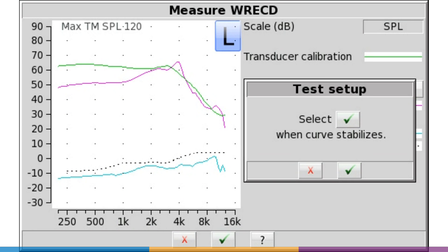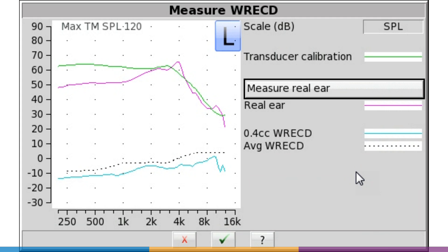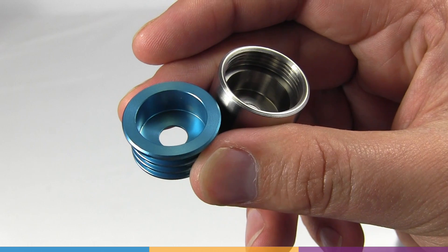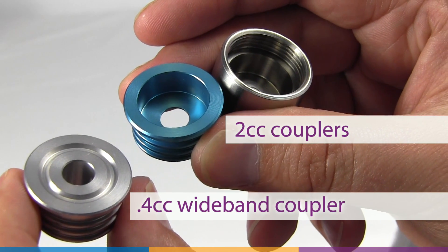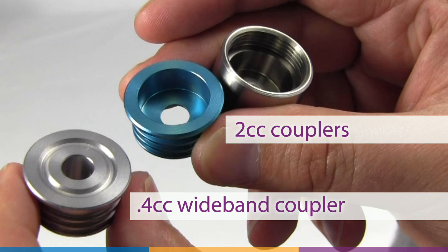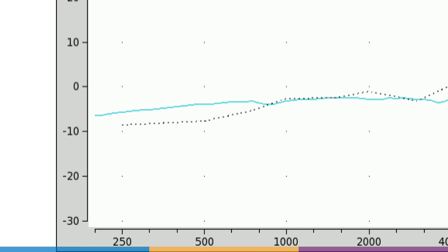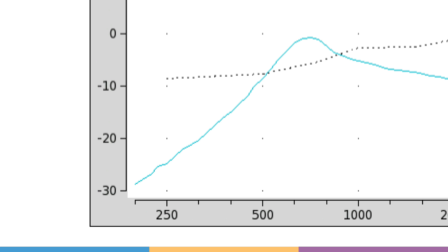The WRECD, the wideband RECD measured on the Verifit 2, also includes values at 8, 10, and 12.5 kHz. It is measured using the 0.4 cc coupler, which is much closer in volume to that of an ear canal. As a result, an average WRECD will typically have values below zero, and negative numbers are not unexpected. However, a leak in the on-ear measurement will still result in a steep roll-off in the low frequencies.